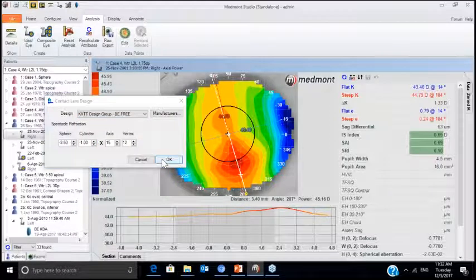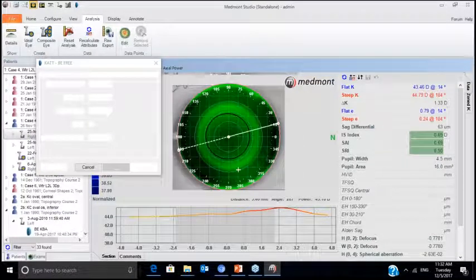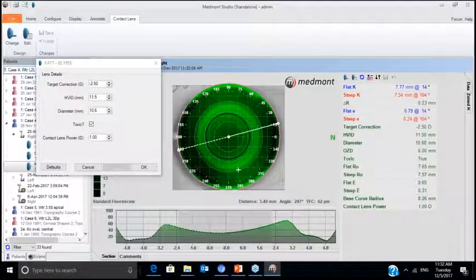and down here. So this might be a problem because we have so much fluid underneath the superior and inferior portion of the lens that our ortho-K lens or our multifocal rigid contact lens or our single vision rigid contact lens will have this gap or this free space to rock back and forth.